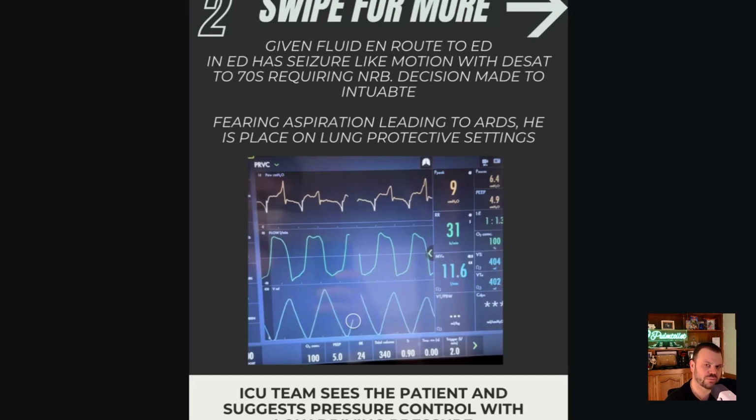If you're going to intubate someone with metabolic acidosis, sometimes you have to, and that's fine, but you have to make sure you're safe with the ventilator. How are you safe? You ventilate with safe pressures by checking plateau pressures based on your volume. You're probably going to have to go a little bit higher, 7, 8 ml per kg, to satisfy your minute ventilation need. And you have to ventilate with safe rates as to not give the patient auto PEEP.